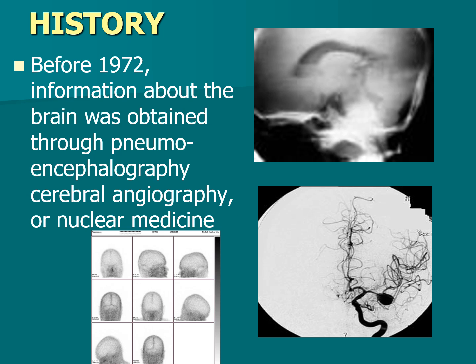Before 1972, any information that was obtained really inside the brain was from a pneumoencephalogram. That is just what it sounds like. You did an intrathecal injection, a spinal injection, and you put air in the subarachnoid space. You took some cerebral spinal fluid out and injected air in. It filled up the ventricles, and even on this general lateral x-ray, you can see the lateral ventricles. They're superimposed here, but you got an idea that these ventricles were of normal size and shape.